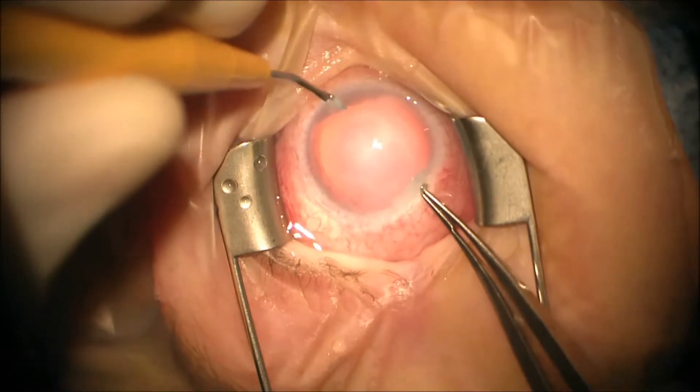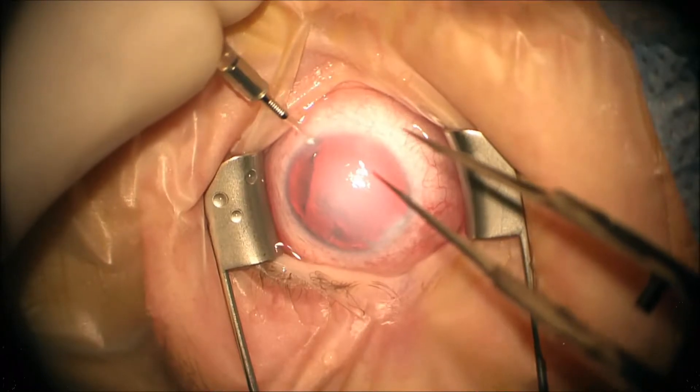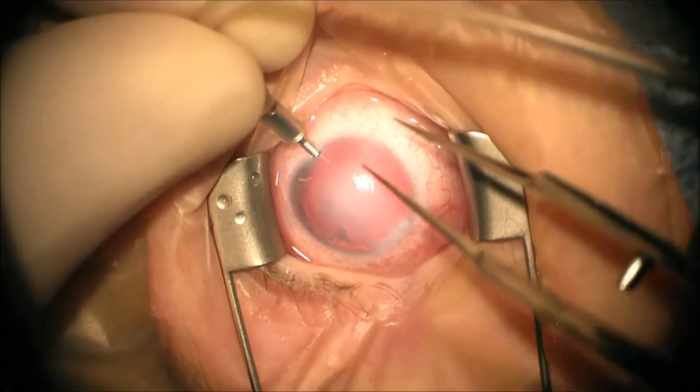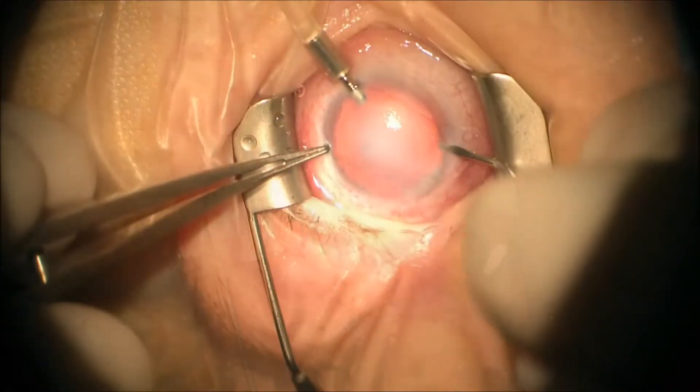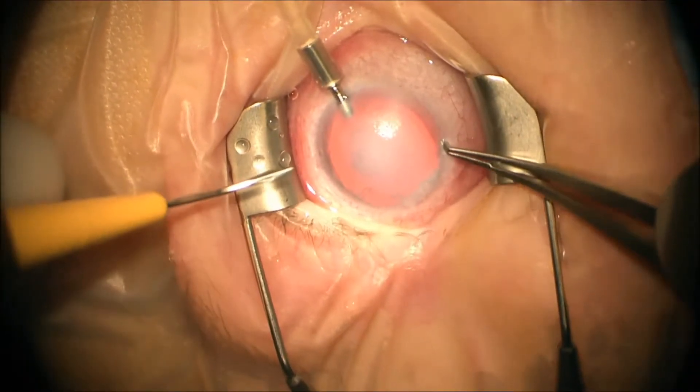We start by making a paracentesis and we use an anterior chamber maintainer. Then we continue to make two more paracenteses, one inferiorly and one superiorly.